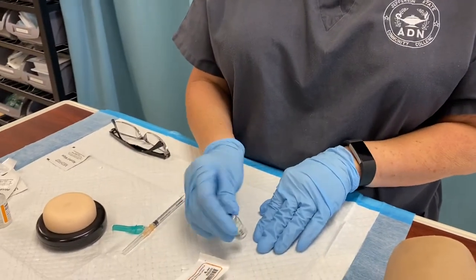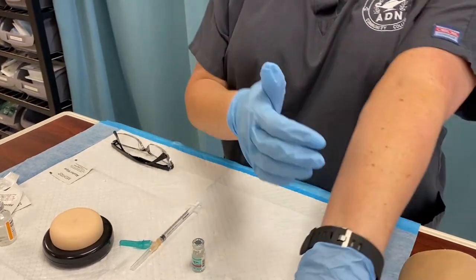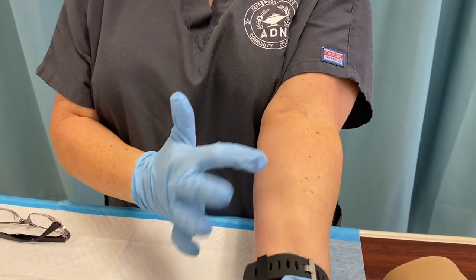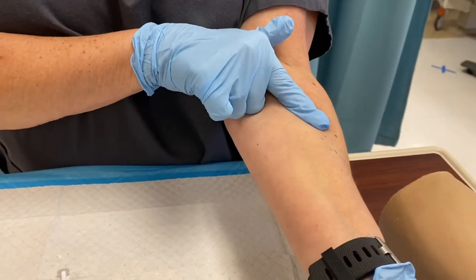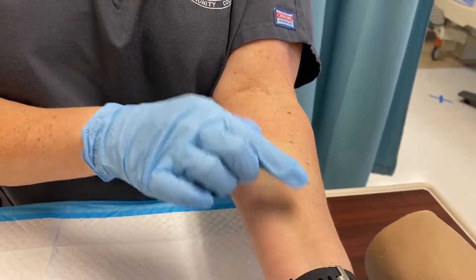Tuberculin syringes are typically the only syringe that you will use with an intradermal injection. We're going to act like this is our tuberculin medication. This is the medication that's given when you go for your TB skin test. The sites for intradermal injection are typically right here in the forearm area. You will not want to insert the needle over a visible vein or visible bruise — you would not want to insert it directly over that in case it were to go into the bloodstream.